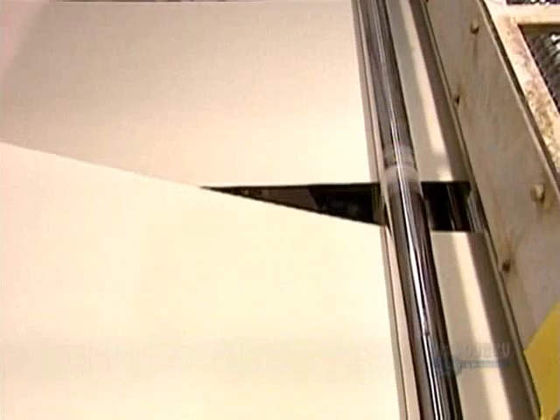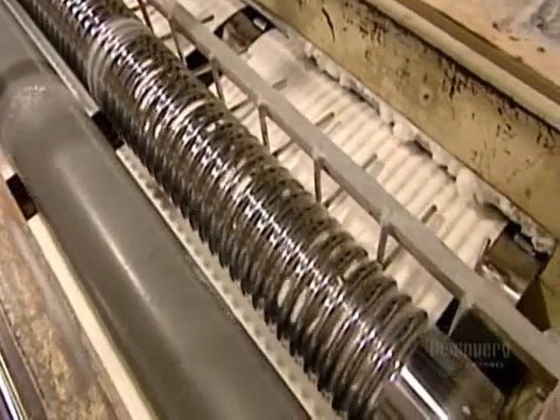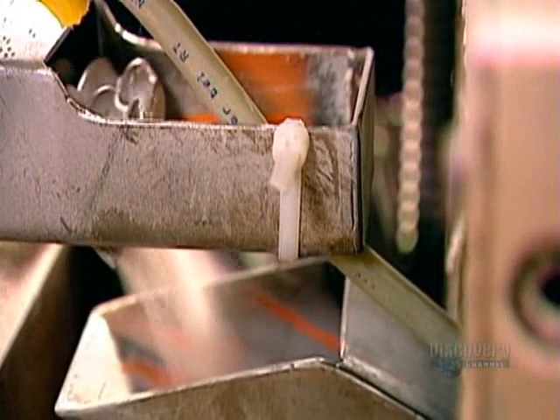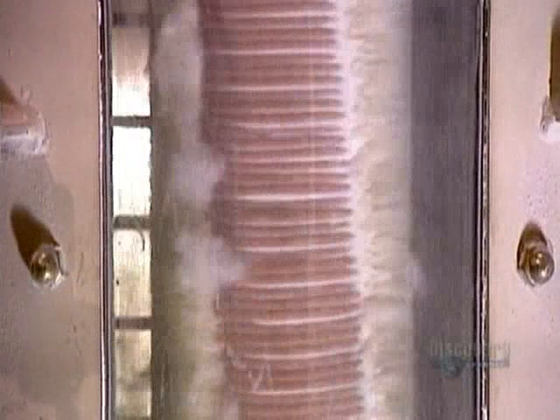Producing sanitary napkins begins with half-meter wide rolls of cellulose pulp. The rolls feed one long machine that does everything. First, knives spinning at 3,000 RPM shred the pulp into a fine fluff. Then the machine sprinkles that fluff with polymer powder.